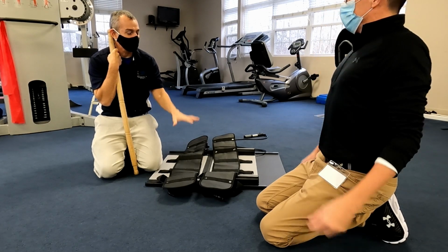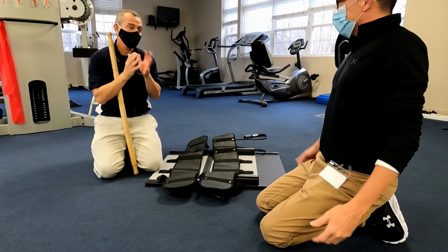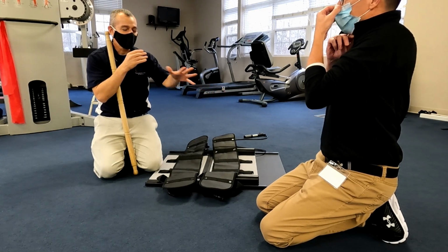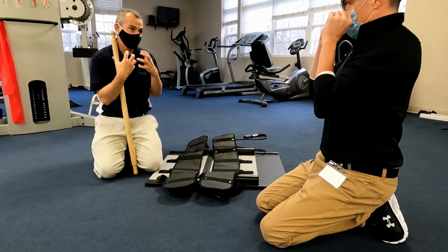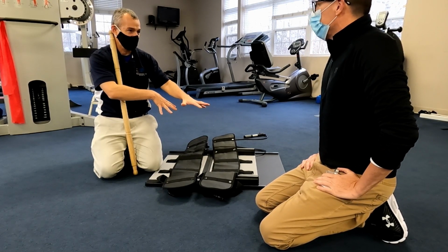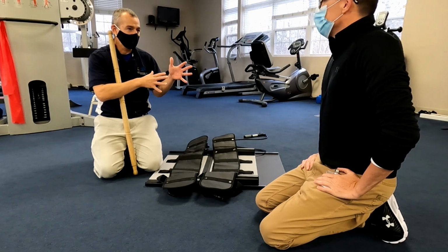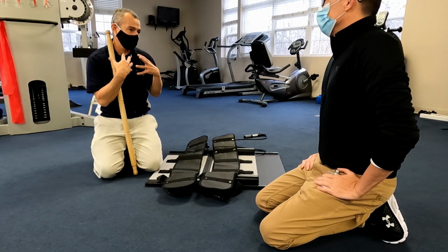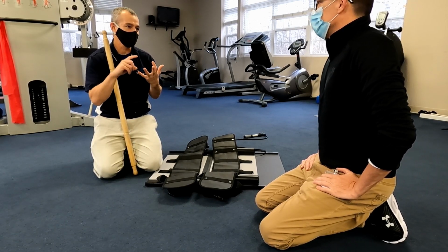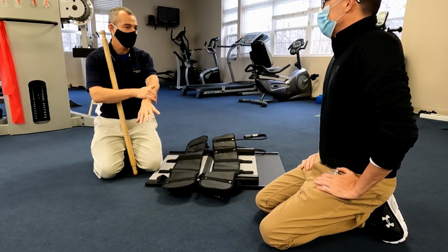And so that's where I go back to the placebo effect, because you're not still under traction. Right. But the nervous system, the brain, and it works both ways. So if I've had pain for the last 24 hours, even if the pain was gone, I would still feel the pain because there's nothing to replace the pain. Now, when you get off of this, you feel the sensation of this. Even if you had pain prior, whatever was going on is back to where it was, but the central nervous system has some information, new sensation. That's what ice does, that's what TENS does, that's what heat does, that's what most mechanical things do. They just give you new information.